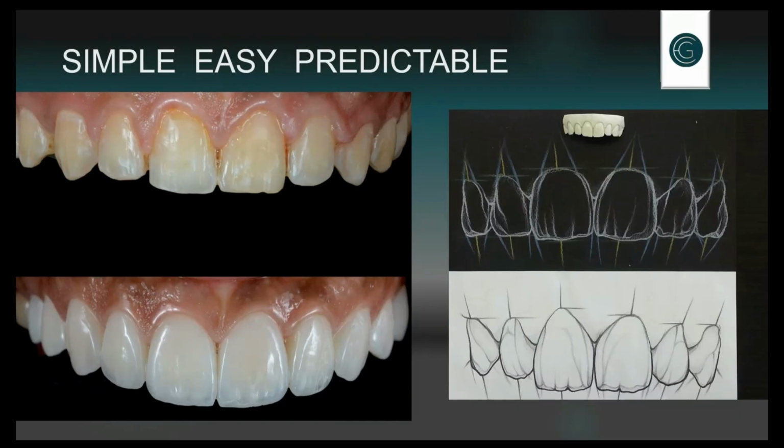One of the things that's amazing is look at, now I'm not saying you need to do this, I like a feldspathic porcelain, a low fusing, kind of like a Trilux Forte, like a 7-layer, whatever it is. But this really shows the tissue and how the tissue adapts to this.